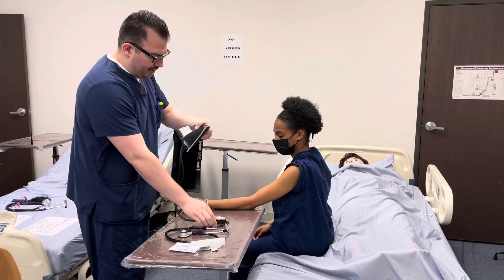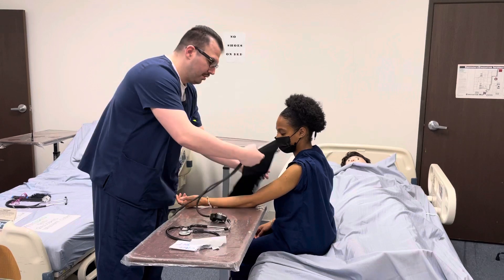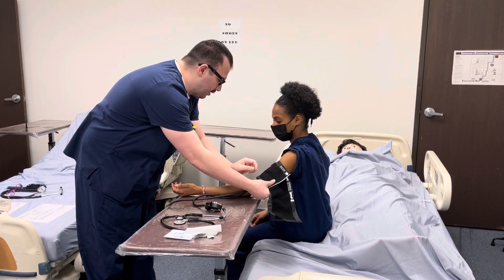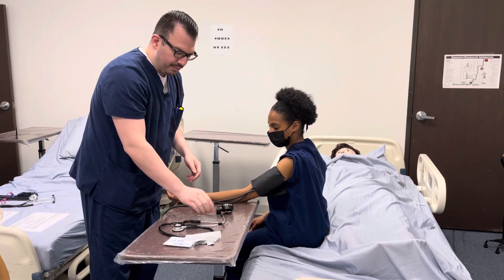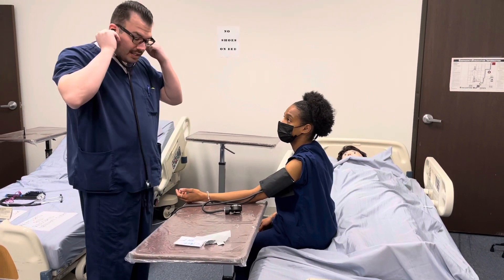This is my patient's left arm, so I will start with the left arm indicator on the brachial artery, which runs along the pinky side on the inside of the arm. I will make sure that I apply it snugly, but not too tight, as it will ruin the blood pressure value and actually create a higher value than it actually is.